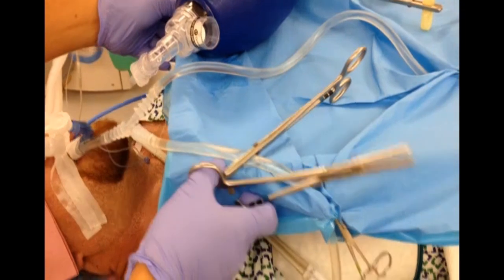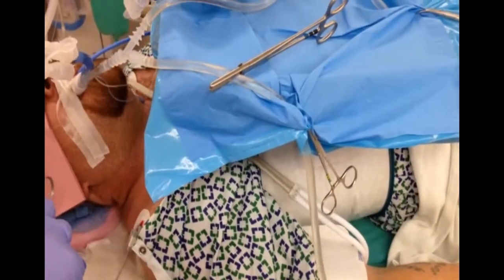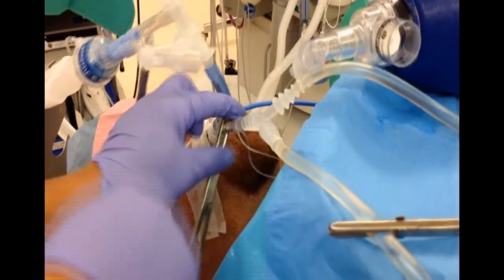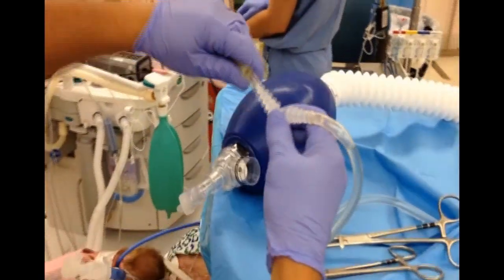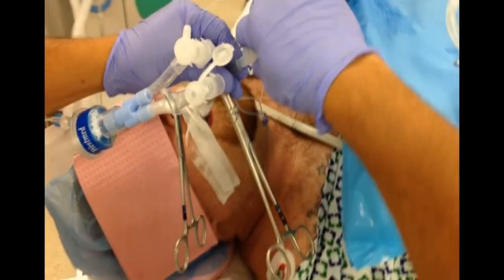In the modified whole lung lavage technique, we fill the lung with about 300 to 500 CC of warm normal saline, then we disconnect the circuit and hook up the Ambu bag to ventilate this lung with very small tidal volumes — about 300 CC or so — a few times, three to five times.